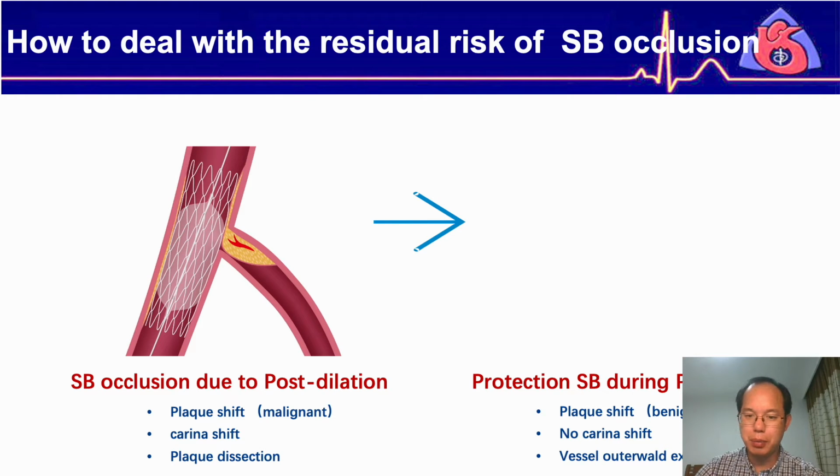We should protect the side branch persistently, not only at the stenting stage, but also at the stage of post-dilation.